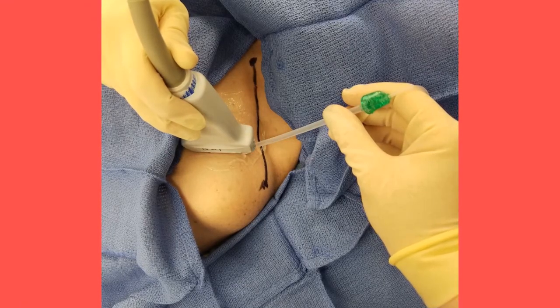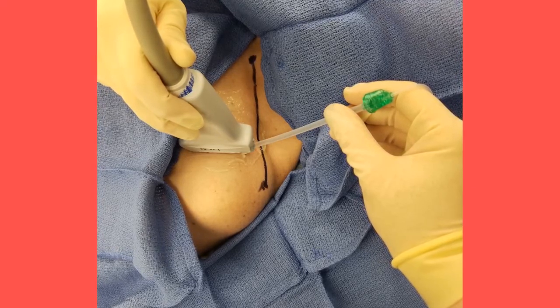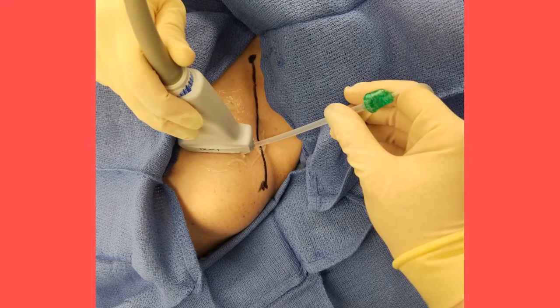For the infraclavicular block, correct needle placement includes an in-plane insertion just below the clavicle. After a negative aspiration, inject local anesthetic in small 5 ml increments for a total of up to 30 ml, ensuring negative aspiration each time. If it is difficult to locate the cords individually, it is acceptable to inject local anesthetic in a U-shape around the axillary artery.